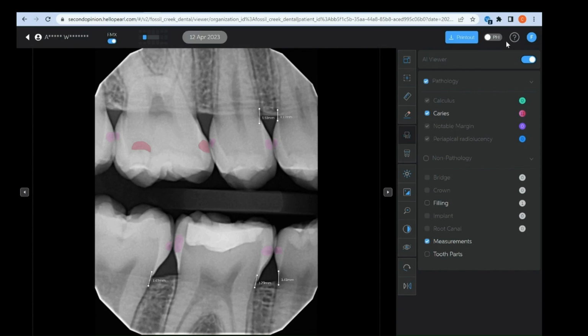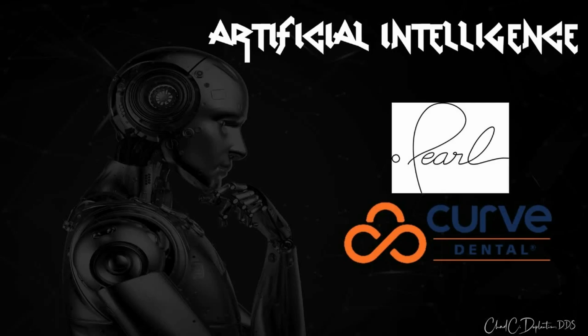I think it's been a great addition to my practice. Once I had it, I certainly don't want to let it go. I really have enjoyed utilizing this in our practice, and it's a great educational tool. We'll never dismiss the power of a keen eye in a clinical examination because we have to correlate these findings with our clinical exam findings as well. But this has been just a fantastic addition, and in my opinion, it's a great merger of two really cutting edge companies in dentistry.